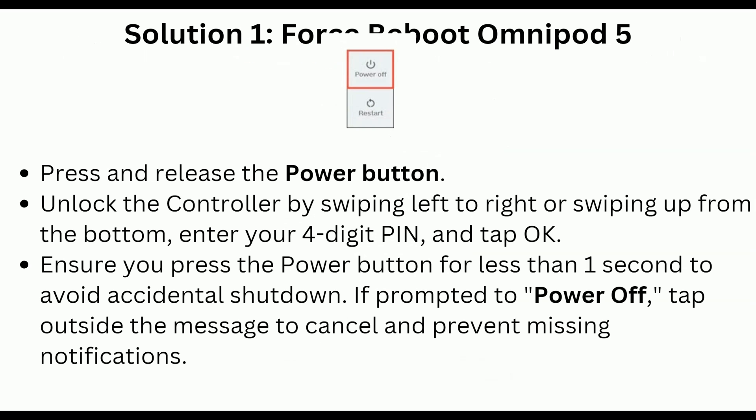Solution 1 is force reboot Omnipod 5. Press and release the power button and unlock the controller by swiping left to right, or swiping up from the bottom. Enter your four-digit PIN and then tap OK. Ensure you press the power button for less than one second to avoid accidental shutdown. If prompted to power off, tap outside the message to cancel and prevent missing notifications.